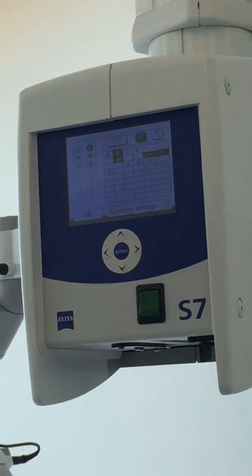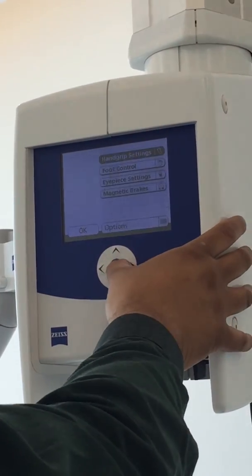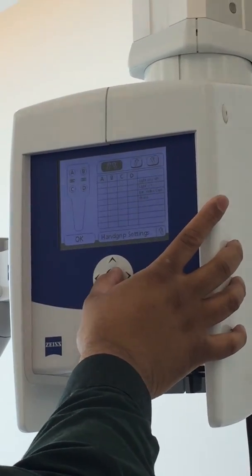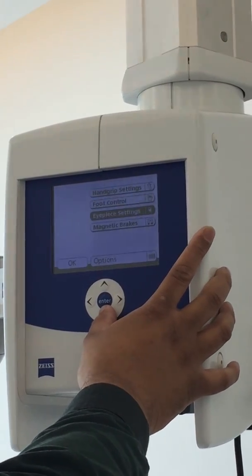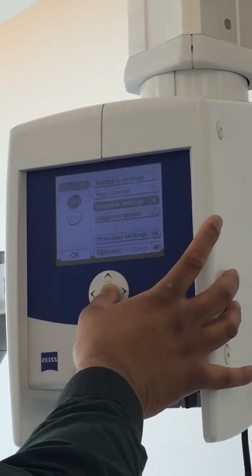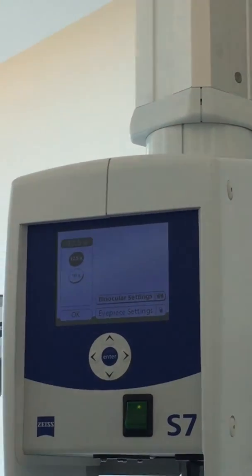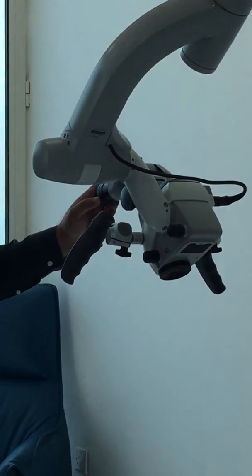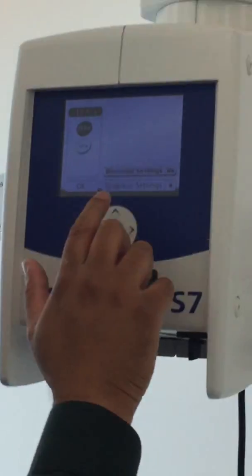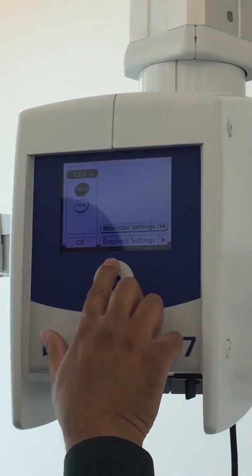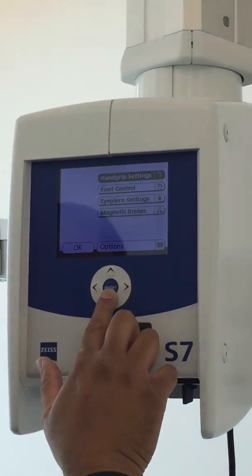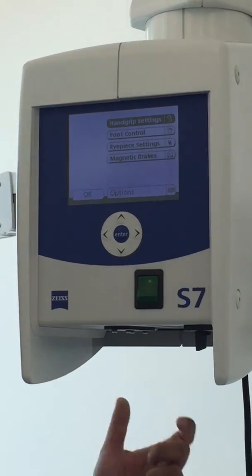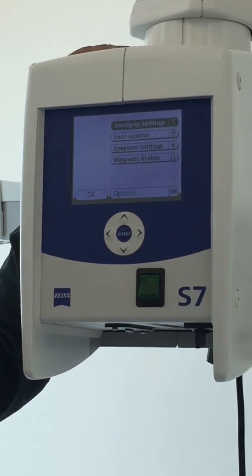The same thing can be done for the other settings. Or you can do it for the foot control. IP settings. This is done once. You can see these eyepieces are 12.5x. So you set it there. Magnetic brakes are always on. Sometimes you find that the brakes are not working. You can come and check here. Double check here. Somebody has switched it off.